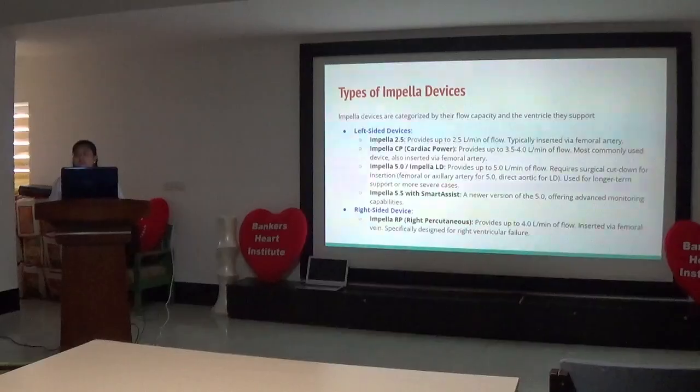So what is exactly the basic difference between IABP and Impella? IABP is also a temporary mechanical support, but in IABP, the work of pumping has to be done by the LV. It is going to just help during diastole and afterload after the blood has been pumped into the ascending aorta. So we are not unloading the workload of the LV.